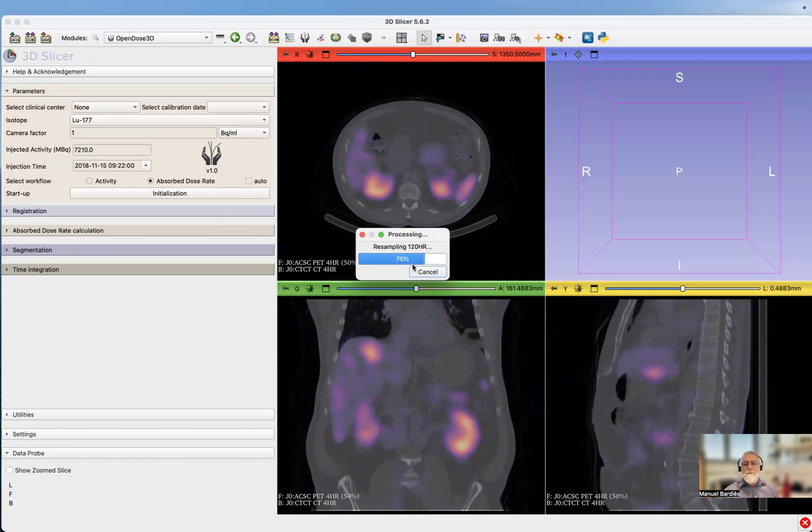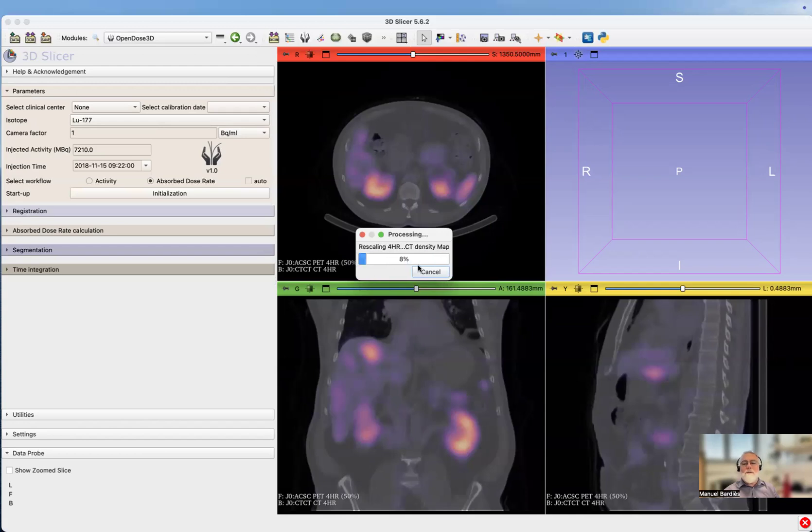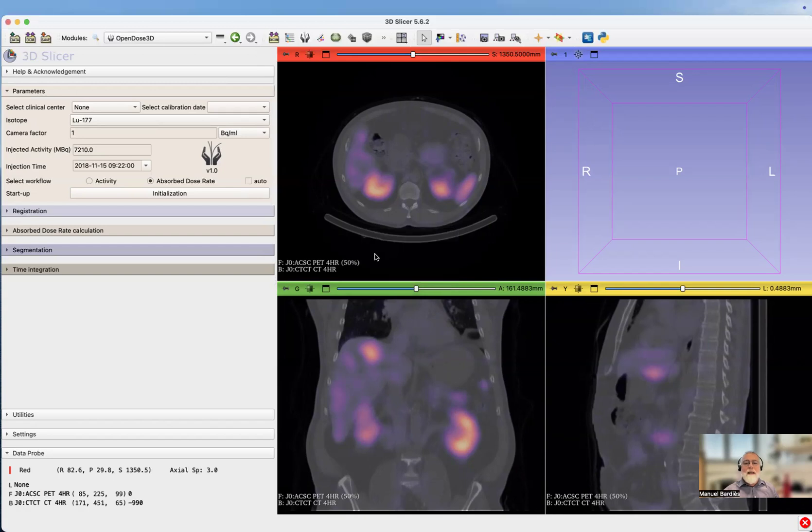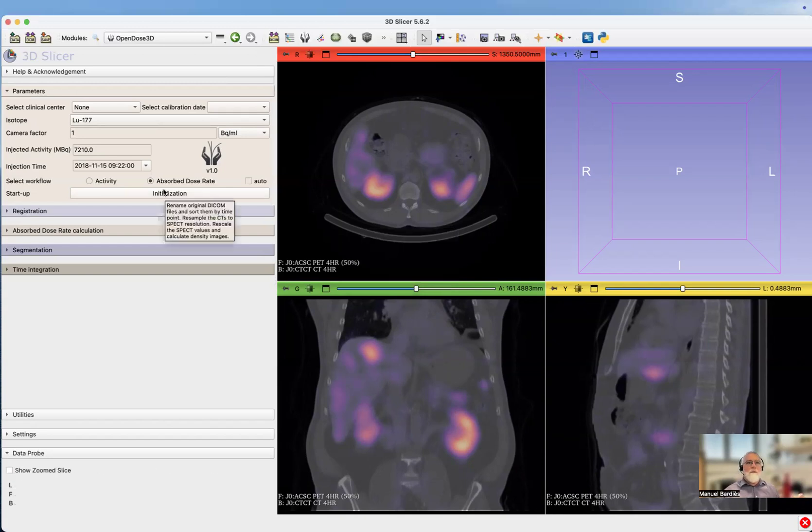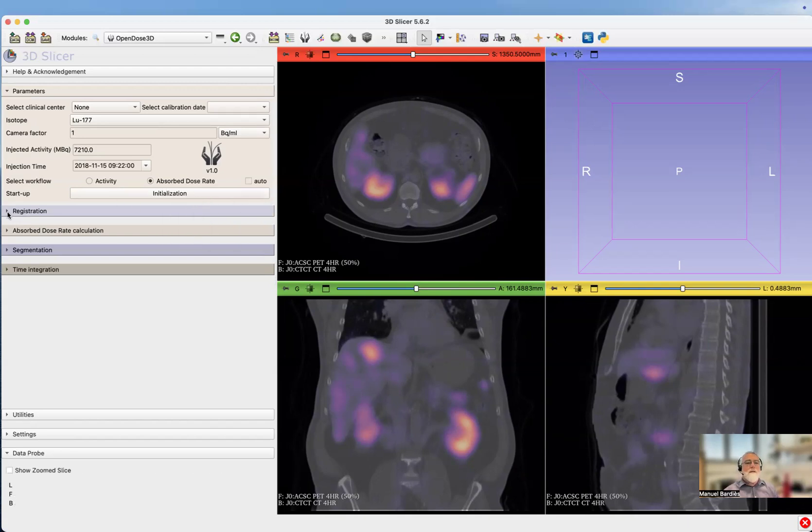Now we have four time points, and the resampling is almost finished. There's a rescaling, moving from count activity and from Hounsfield to density. The initialization step is done.